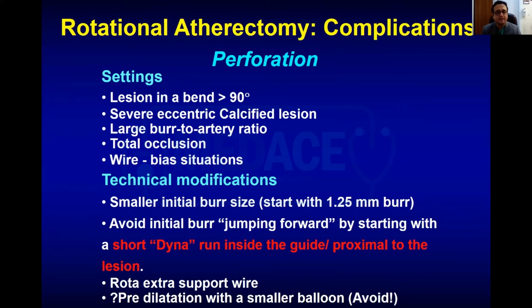The other day we had a patient with just an isolated LAD lesion, and the patient actually had two 90-degree bends in her LAD, and both were severely calcified. We could not even get a 1.0 balloon or a microcatheter across. So we decided not to rotablate it, because you can be Rambo and try doing things, but a low-risk patient can go for surgery. Sometimes saying it should not be done is actually better than doing it and then repenting it.